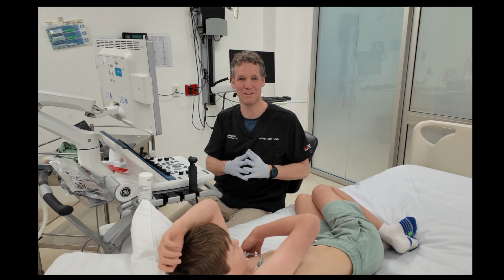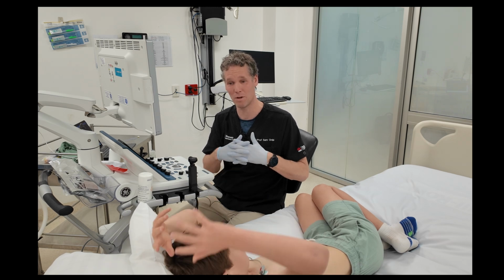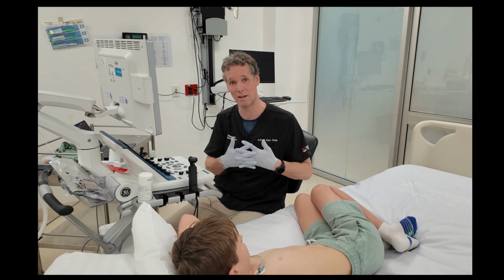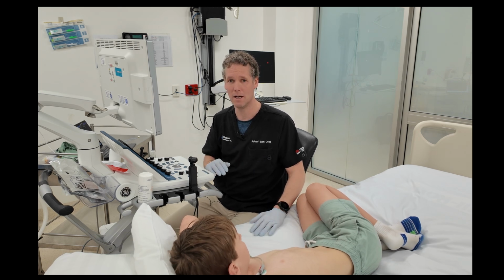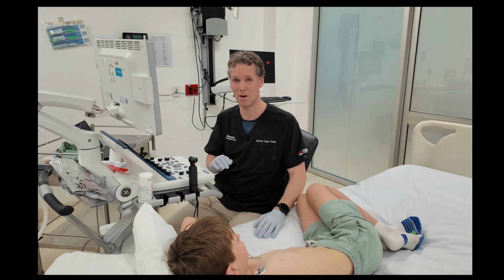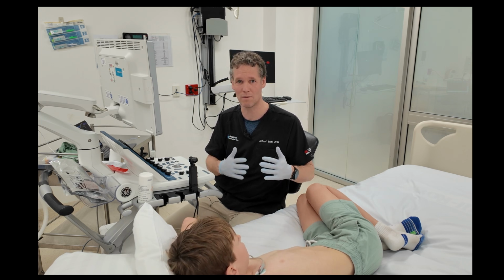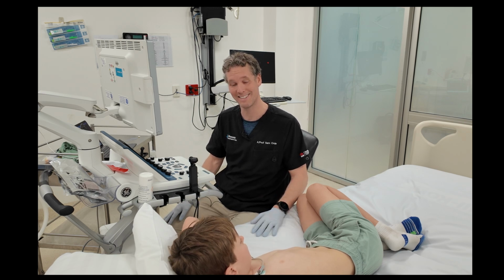I'm an adult ICU specialist at Nepean Hospital. We're going to try and do a demonstration here about how to do a focused paediatric scan. As I said, I'm not a paediatric intensivist, I'm an adult intensivist. So I'm going to try and use some of these tips and tricks that I've learned from doing adult scanning to try and scan my son Jack.